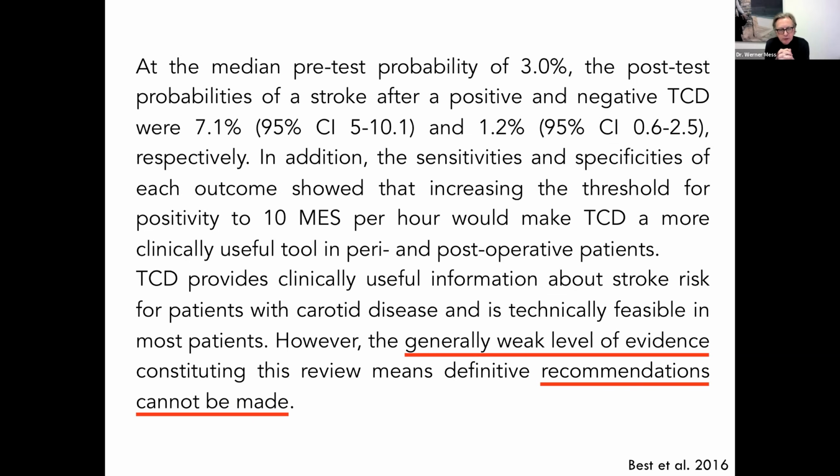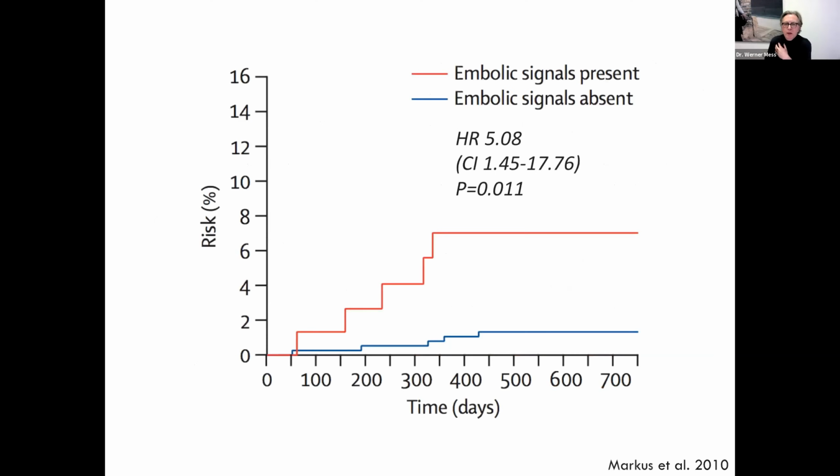In my opinion, it means that you have to think yourself. Are the data, for example the ones I just showed you, enough for you to, at least in difficult patients, adjust your therapy on the basis of microembolus detection? I think it's definitely worthwhile to think about it.